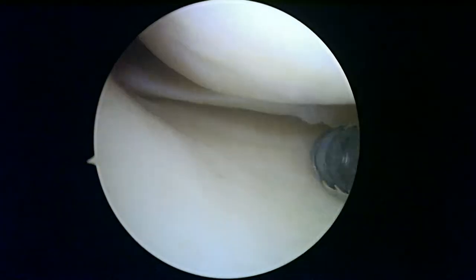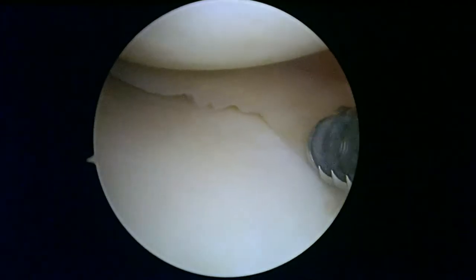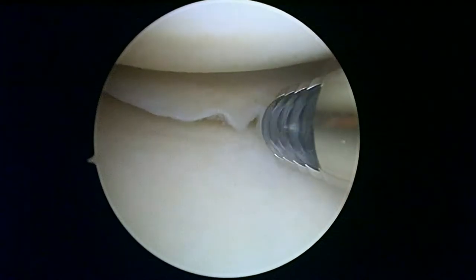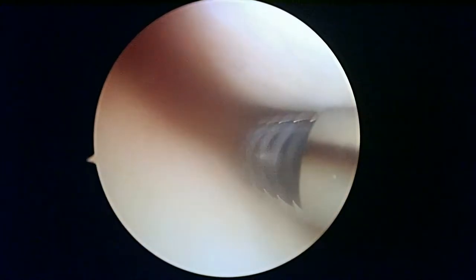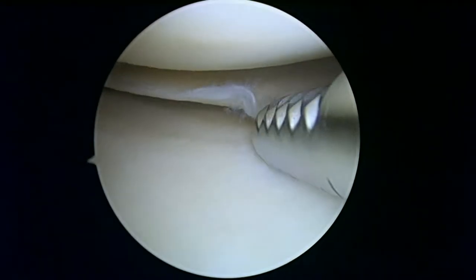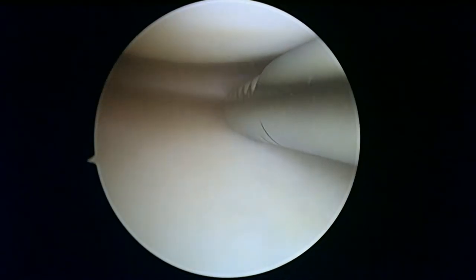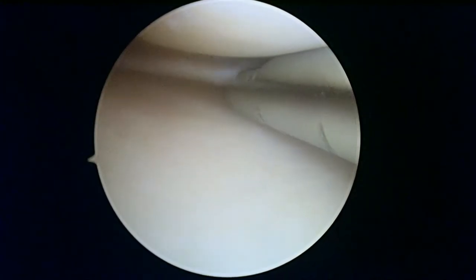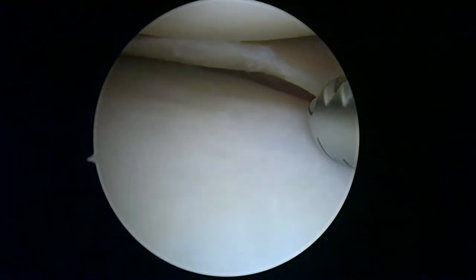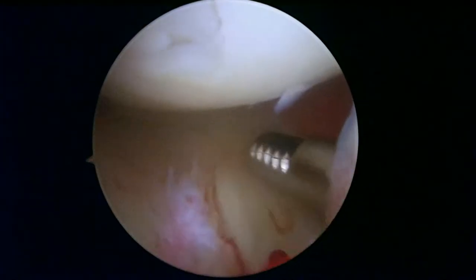Here we are looking in the medial compartment on the right knee. We're just getting started — there's some minimal fraying on the radial edge here. We're going to turn on the suction because that allows us to irrigate so we can see a little bit better. This meniscus on the inside looks pretty good; there's maybe a little bit of fraying. The shaver has suction on it, so if there's anything truly unstable it'll come right to the shaver, but that actually looks pretty good.